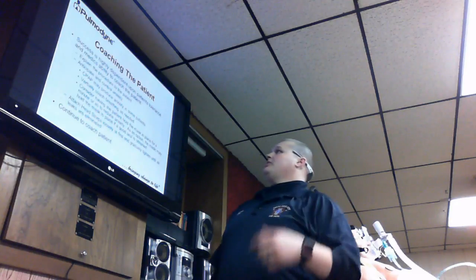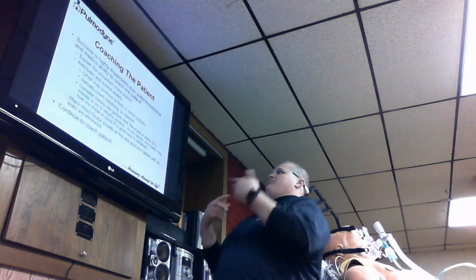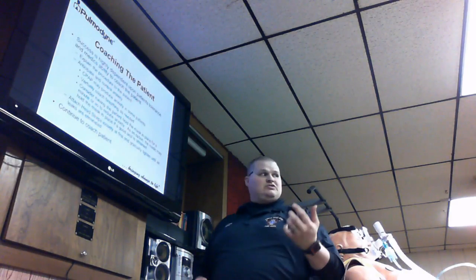You want to tell them, hey, what's going on? It may produce some anxiety. Verbally coach the patient: nice deep breaths into their nose, out the mouth. Take that anxiety away from that patient as well, okay?